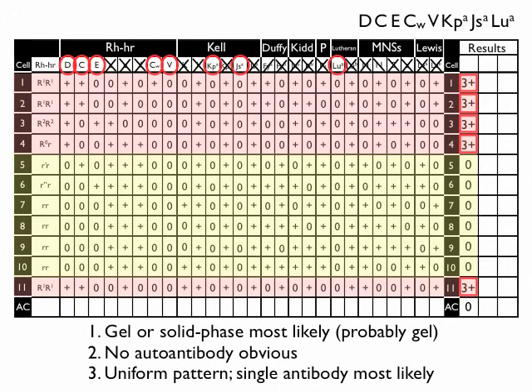Let's look first at the D, the big D antigen. Well, where do we have big D? Well, that's pretty obvious. Every place we have a reaction, we have the presence of a big D antigen. So that would absolutely fit as a single antibody explaining all the reactions. So I would circle big D. I certainly wouldn't rule it out. In fact, I would think that this is probably going to be an anti-big D. But let's not ignore the other possibilities.